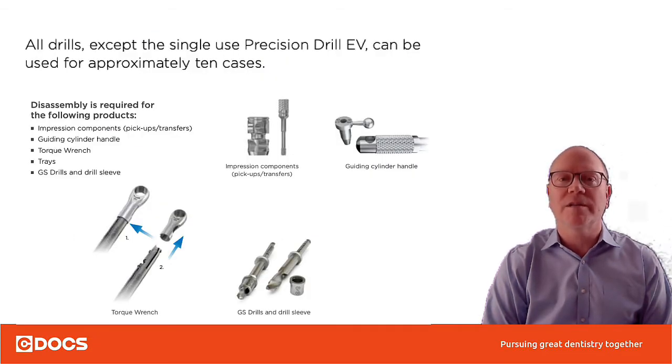Another tip is to remember you can only use these drills for about 10 uses, then the drills need to be thrown away. For the implant kit, the important thing about disassembly is to disassemble the torque wrench and also to take the sleeves off the drills before you clean them and put them in for sterilization.